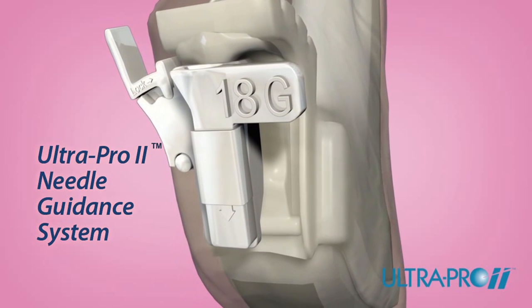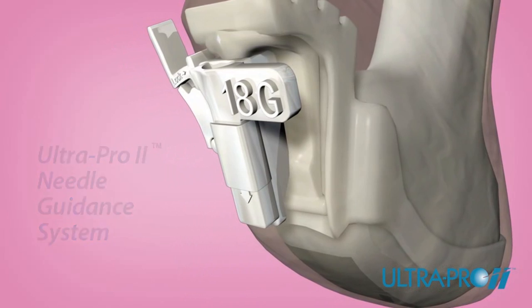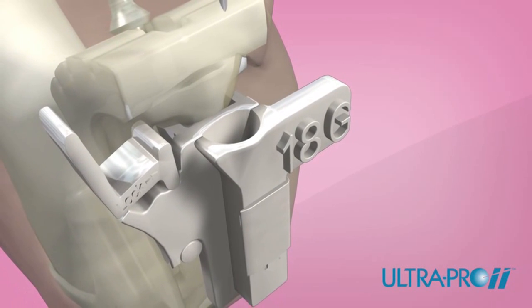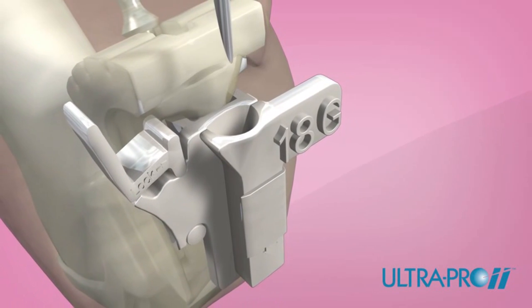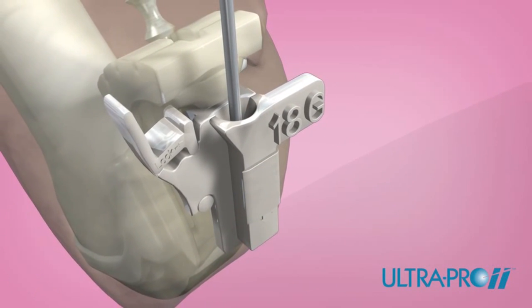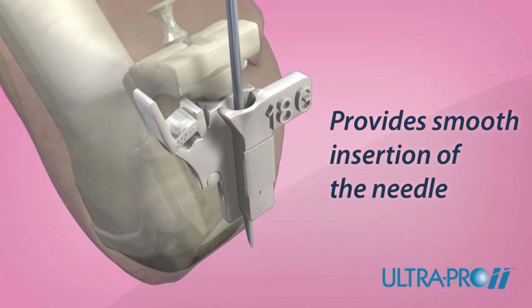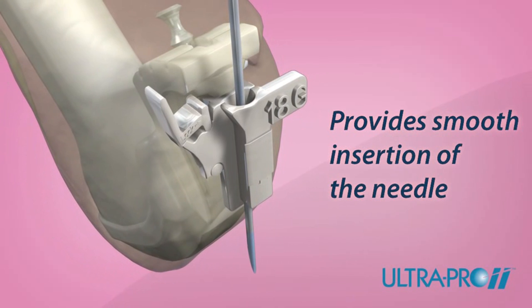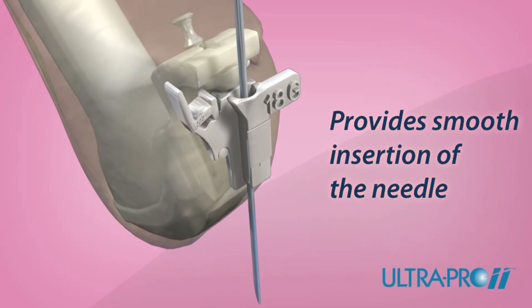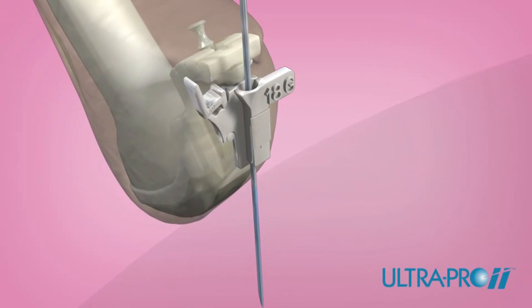Once the guided inserts are secured, the UltraPro 2 needle guidance system is ready for use. The UltraPro 2 features a large funnel-style insertion point, allowing for quick instrument placement. Placing the transducer and needle guide assembly over the targeted anatomy, insert the needle through the funnel-style insertion point. The UltraPro 2 holds the needle in plane as it is advanced, providing smooth insertion while allowing you to see what you puncture.